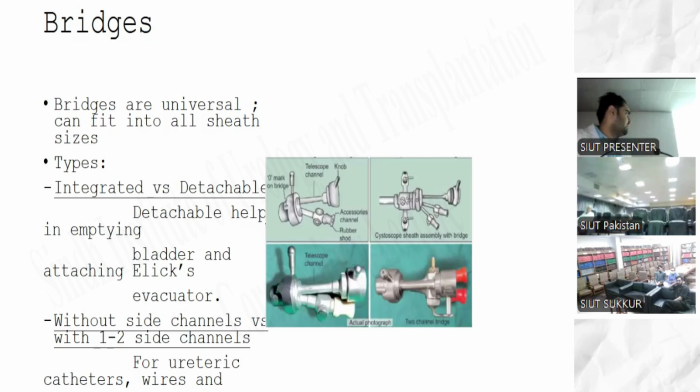And this is again a knob. This is the telescope, right? And these are the working channels of the bridge.